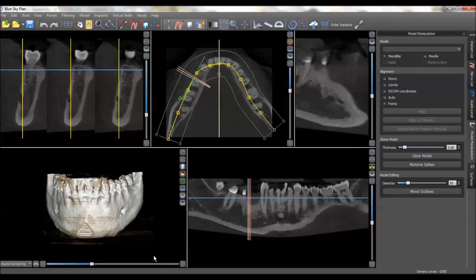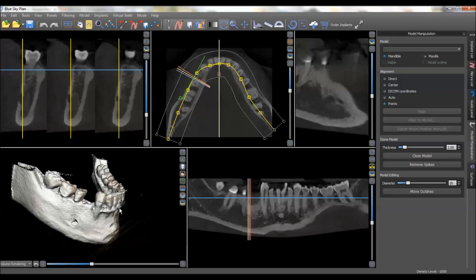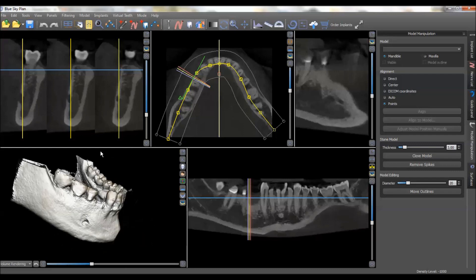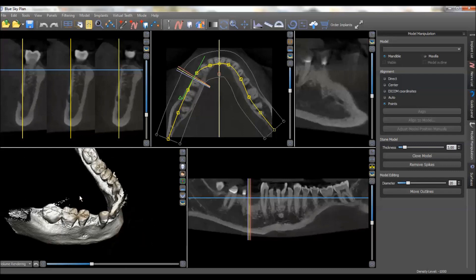Hi, this is Dr. Corey Glenn and I'm going to do a quick demonstration of how you would plan a case for a routine tooth-borne stent using Blue Sky Plan for replacing just a single lower premolar. This would be number 28 in this case.